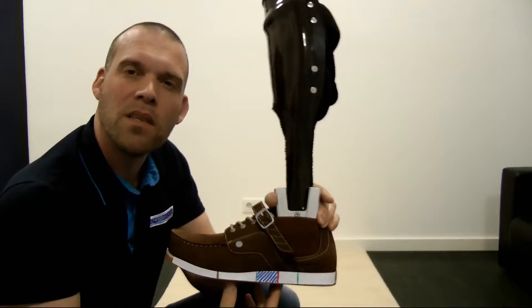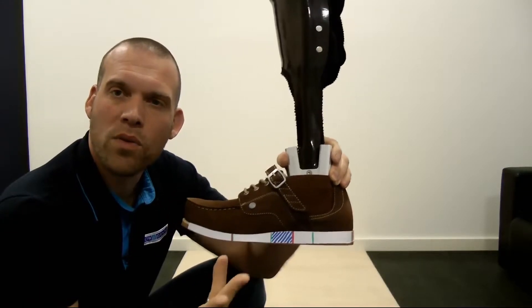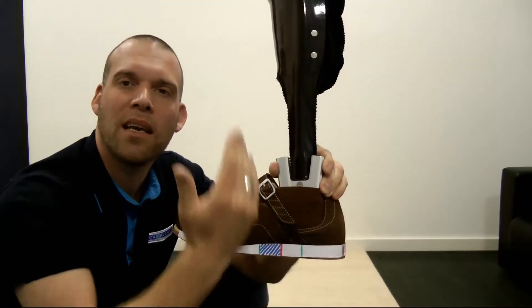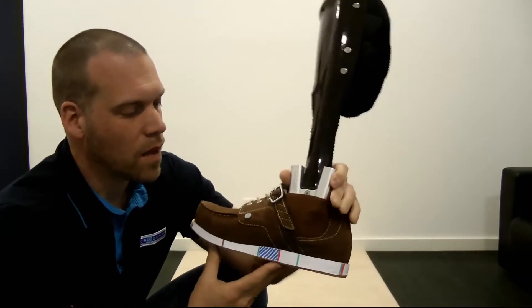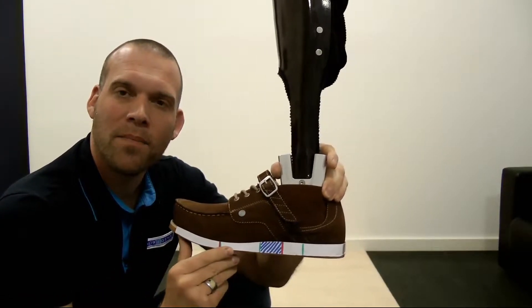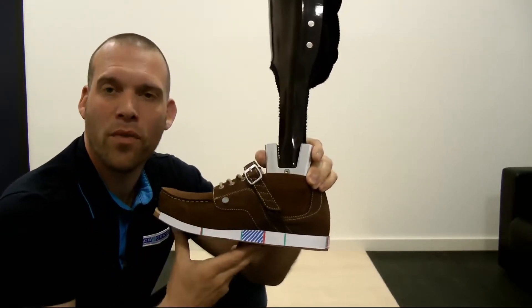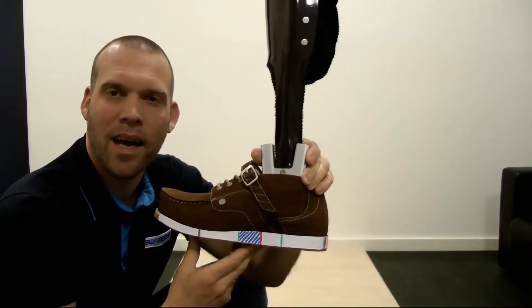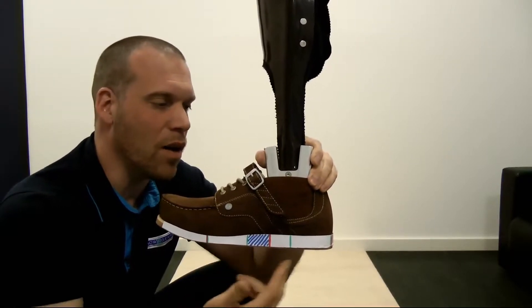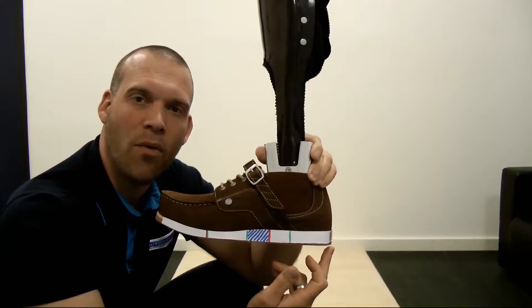The supportive area in this case is actually the foot. The foot significantly increases the supporting area for us bipeds and thus enables us to stand on two legs. But for our patients, who are usually not able to move their toes, this is a very special situation. We have to explain which supporting area is available for the patients a little more precisely than in the physiological sense for bipeds, because the support surface does not include the entire length of the foot.